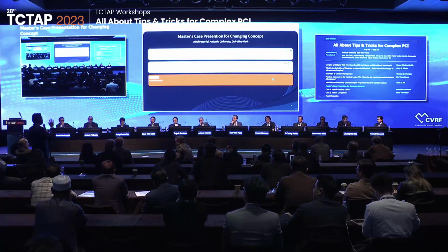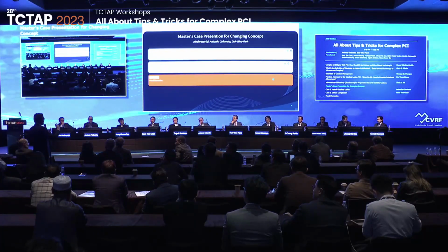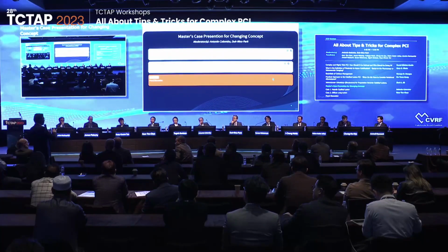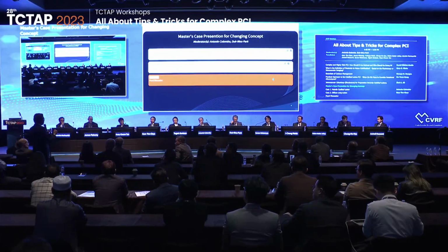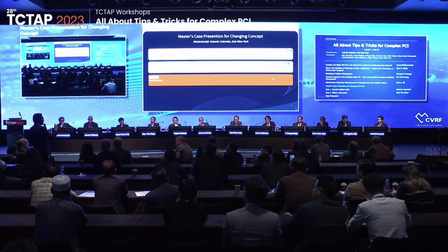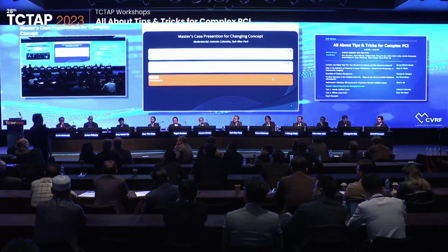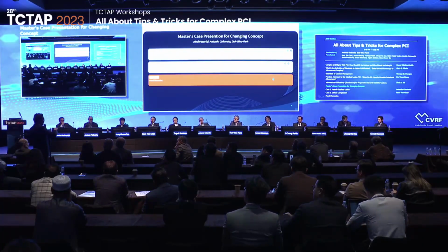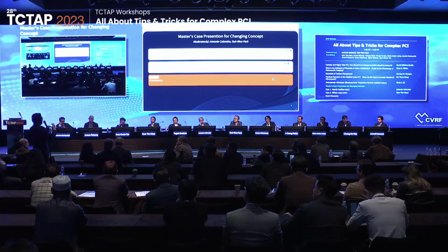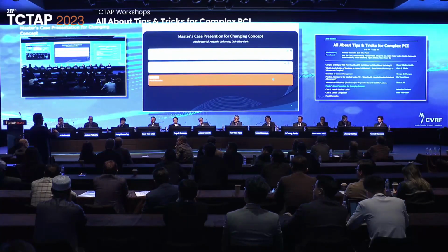When you see a nodule, start with an NC balloon. If you use an NC balloon and on stent boost or device detection, the nodule disappears, put a stent. If it doesn't disappear, there's two possibilities. And the one that IVL can modify is that you have a marble on top of a rock. You need to break the rock underneath, and that's why the Shockwave helps. So if you crumble the rock underneath, you can push the nodule into it.